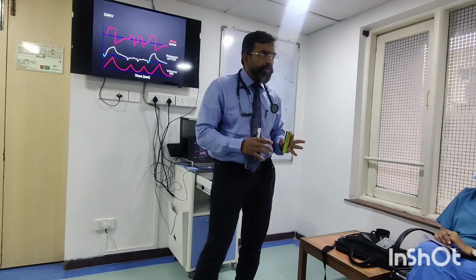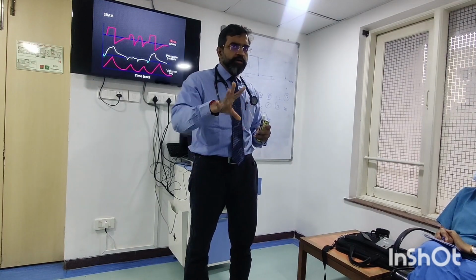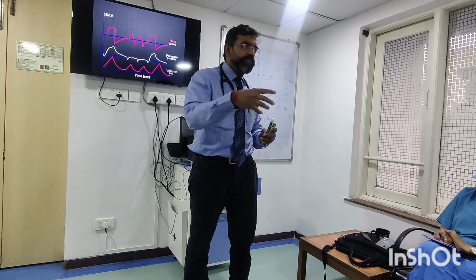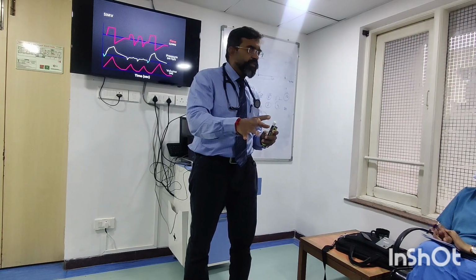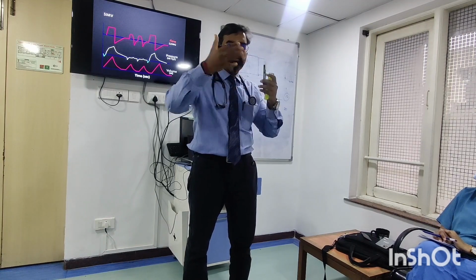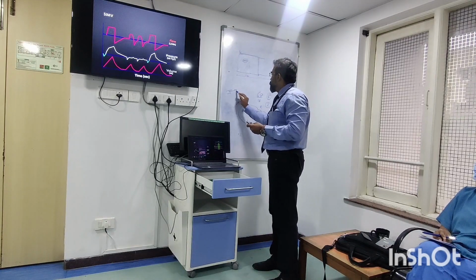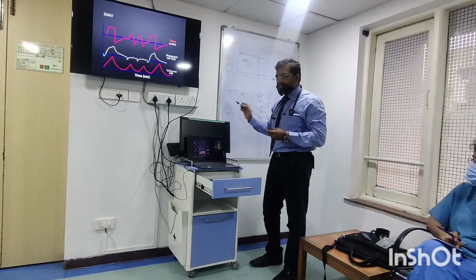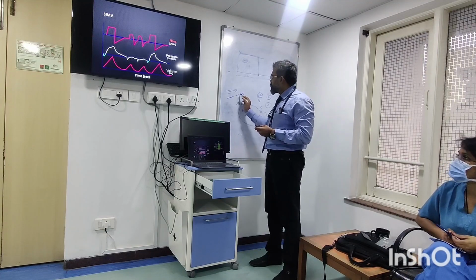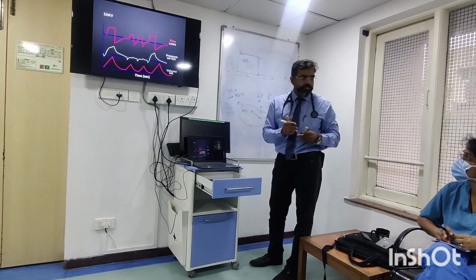Till now, like an ambu bag, it was just giving breaths. If the patient is breathing or not breathing, it doesn't matter. If the patient wants to breathe out, he cannot, because the ventilator is not allowing it and all the valves are closed. In inspiration, the valves open and the patient gets the breath. After the breath, the valves close. Whatever happens, the patient cannot inspire or expire because the valves are closed down.